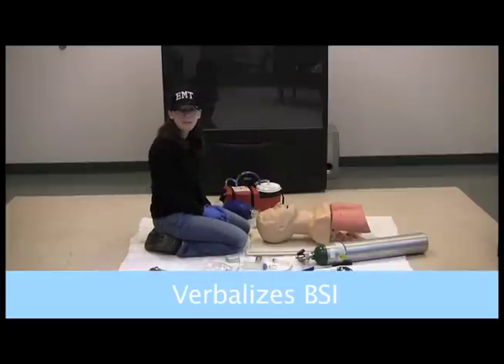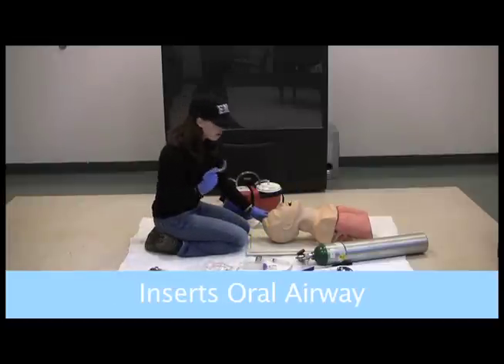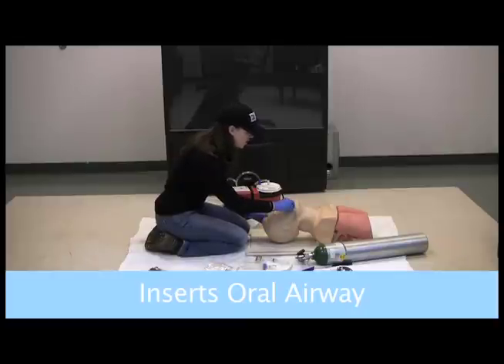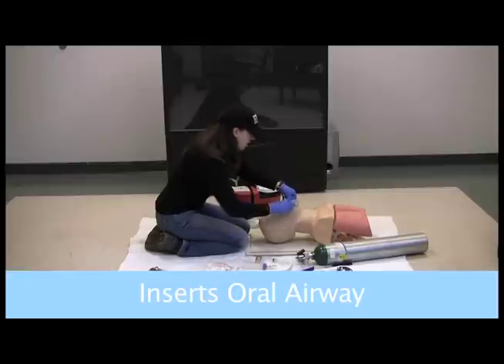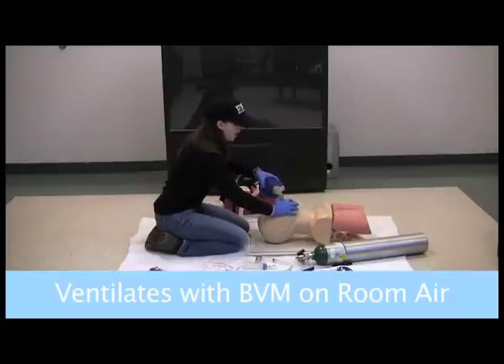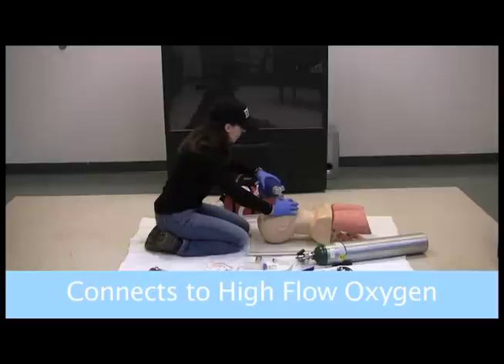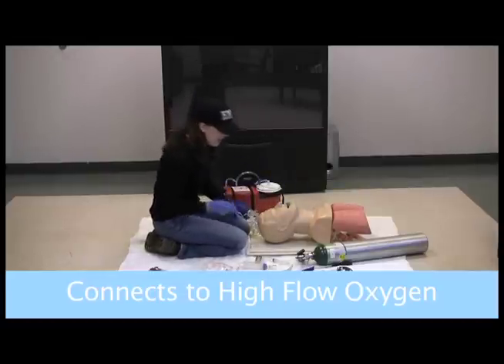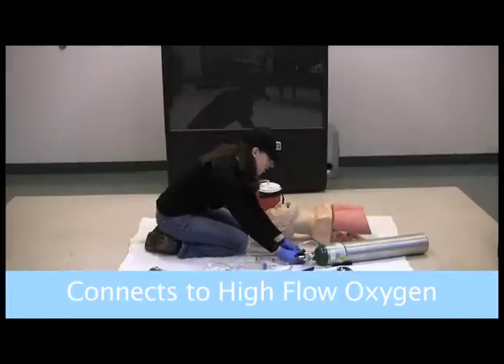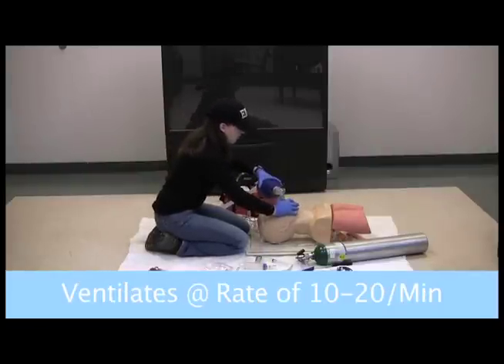I've got my BSI on. I'm not worried about spinal precautions on this patient, so I'm going to go ahead and do the head tilt chin lift. I have my oral airway that I want to measure from the tip of the earlobe to the corner of the mouth. After I have that inserted, I have the appropriate size BVM. I get a good seal, and I want to hyperventilate the patient. The patient is on pulse oximetry at 85%, so I really want to get this patient on high flow O2. I'll hook it onto the oxygen unit, turn it up to 15 liters, and I can continue with my ventilations.